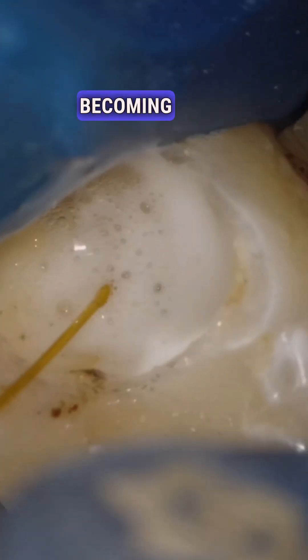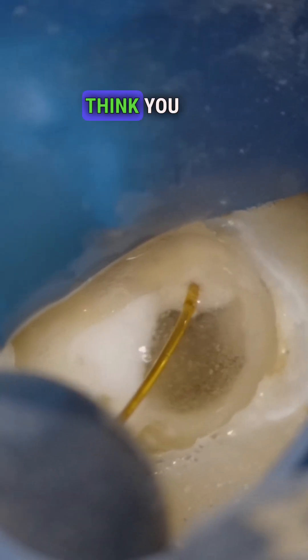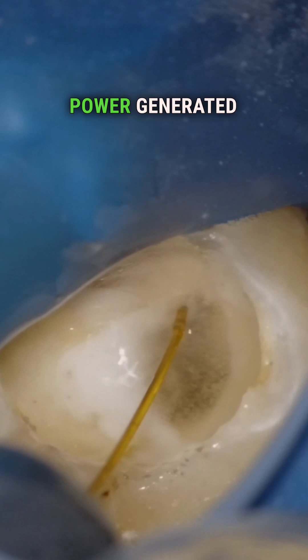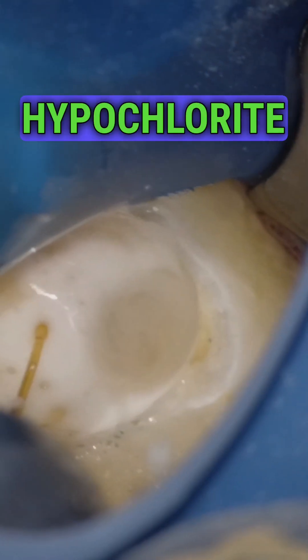But it's clear that they're becoming more popular because the technologies are more attainable. And although we don't have a tremendous amount of research that we can really lean on, I think you can see from the power generated that from the eyeball test, there is quite a bit of activity and you feel that you're utilizing the sodium hypochlorite to its maximum.